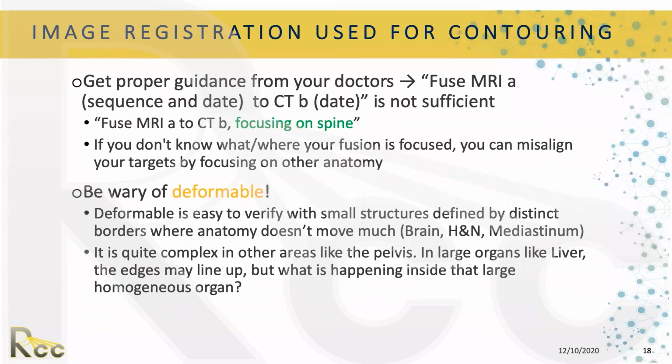Also, it's very important to get proper guidance from your doctor if you're doing the image registration. It's not sufficient to say, okay, fuse the MRI from this day and sequence to the CT from this day. That's good data, but they should also tell you to focus on something. For example, fuse this MRI to this CT focusing on the spine, because I know that my targets are going to be around the spine.